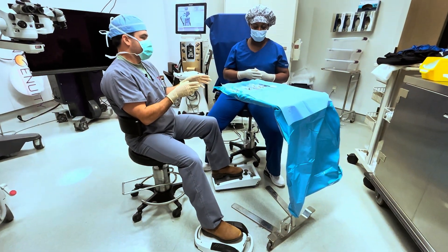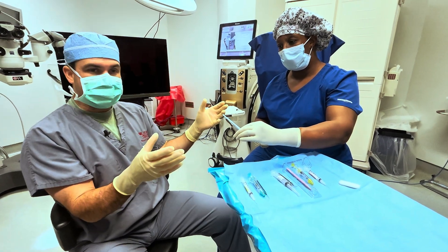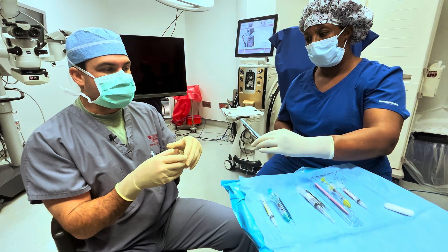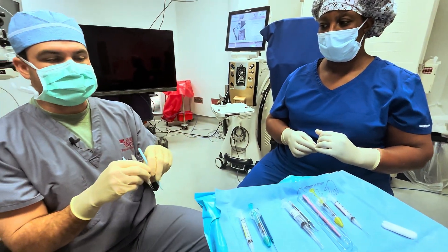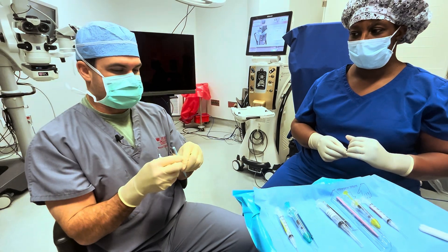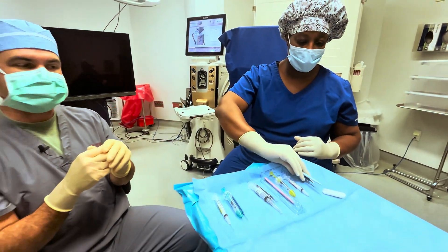You only have two chances to stab each other in cataract surgery typically — it's when you pass the 15-degree paracentesis and when you pass the keratome. I grasp, and I allow her to release once she's clear, then I move. That avoids pulling sharps through someone else's hands. When I'm done, I'm going to hand it back. She's going to grasp and allow me to release before she moves it.